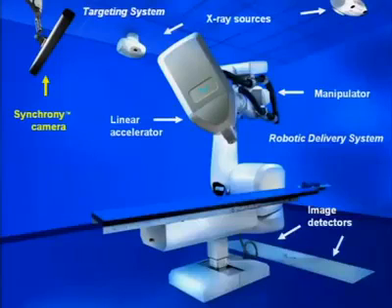And again, we have here a picture of the more sophisticated system put up by the CyberKnife people. But this time the X-ray sources are mounted on the ceiling, and they look stereoscopically at the patient and using image detectors located in the floor.